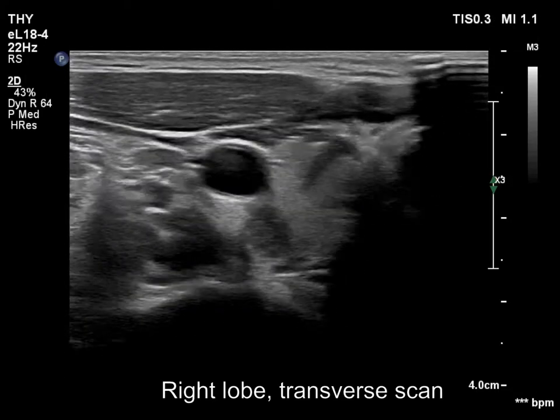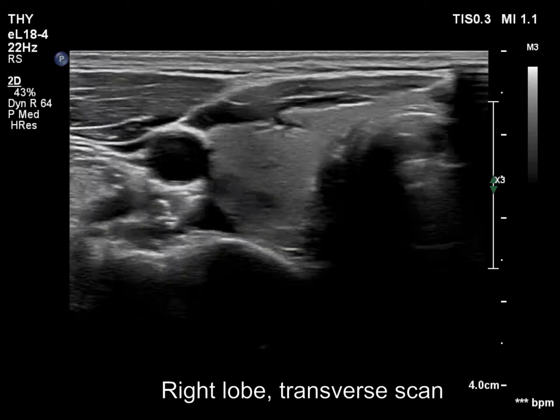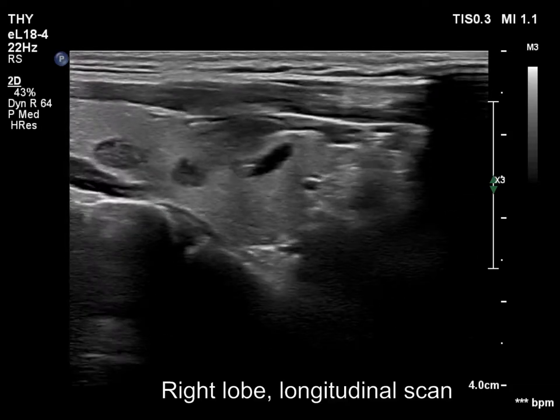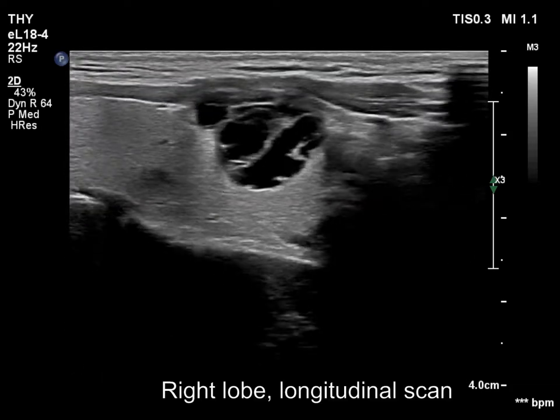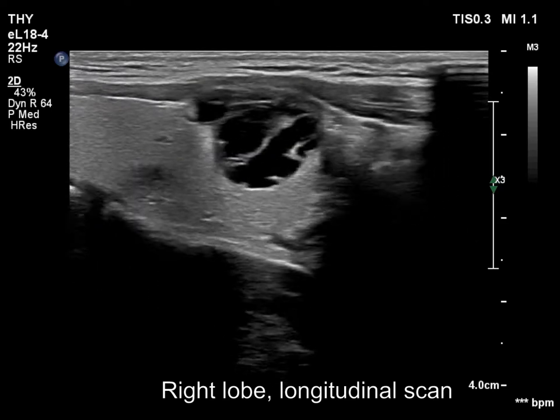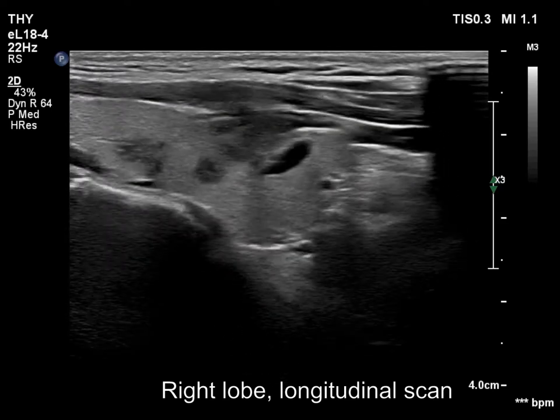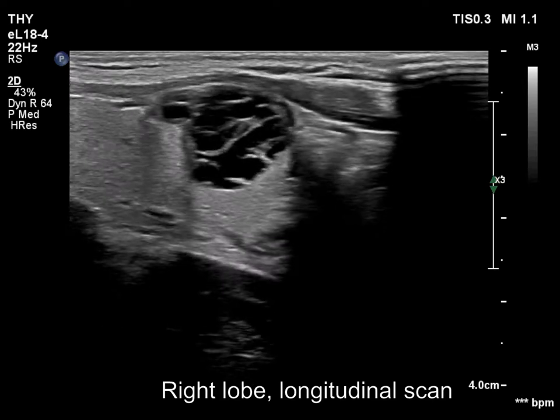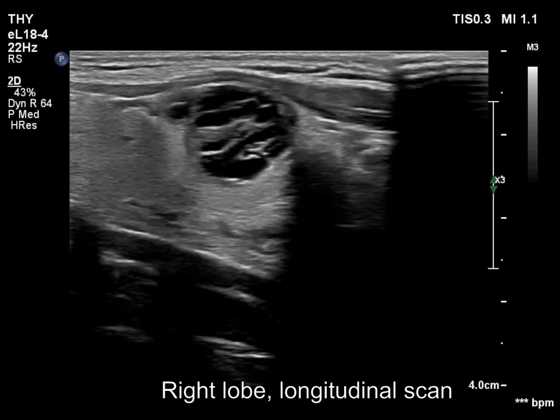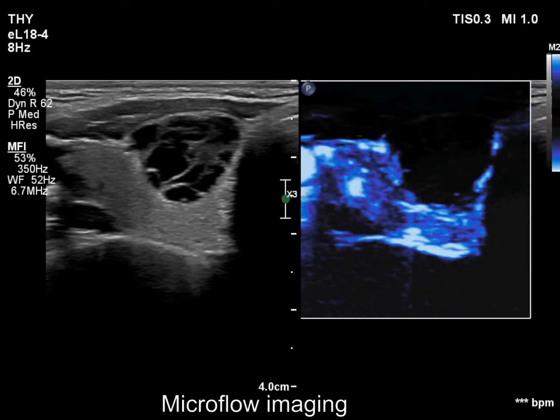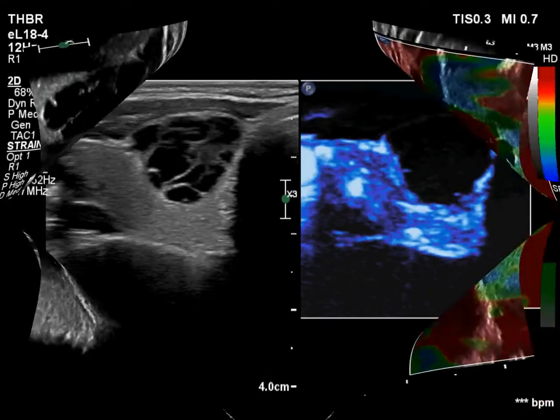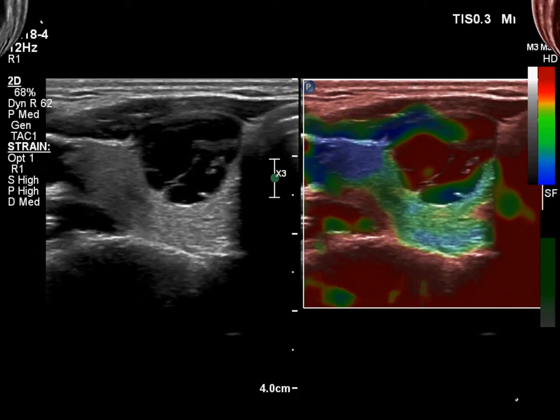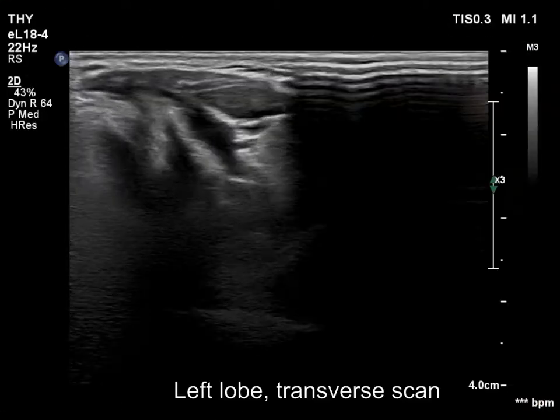The right lobe has a multi-chambered cystic nodule which has spongiform areas and echogenic solid parts. The lesion is avascular. The stratification of levels with different stiffness is typical of a cystic lesion.